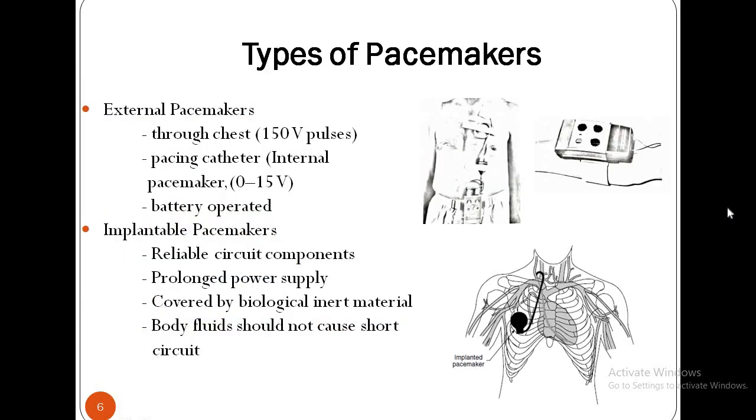The classification of pacemakers into different types is based on the mode of application of the stimulating pulses to the heart. Based on the placement of electrodes, we have external, internal, and implanted pacemakers. External pacemakers are employed to restart the normal rhythm of the heart in cases of cardiac standstill, in situations where short-term or temporary pacing is considered adequate, while the patient is in the intensive care unit or is awaiting implantation of a permanent or an internal pacemaker.